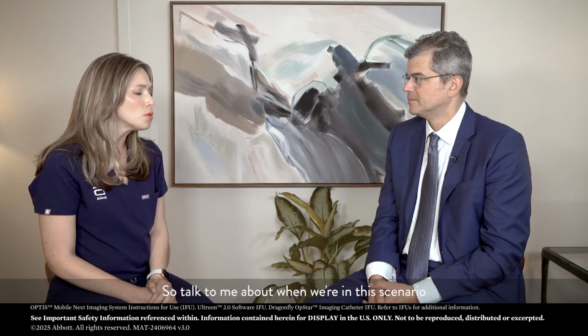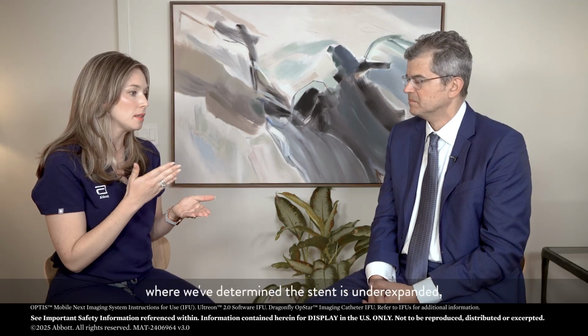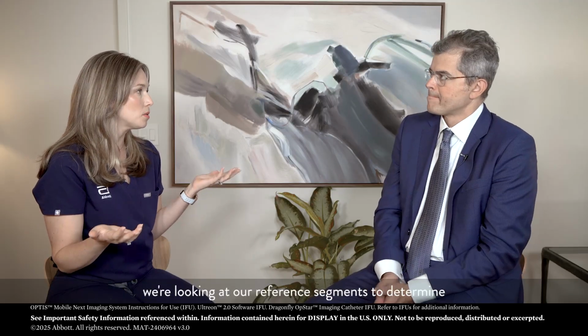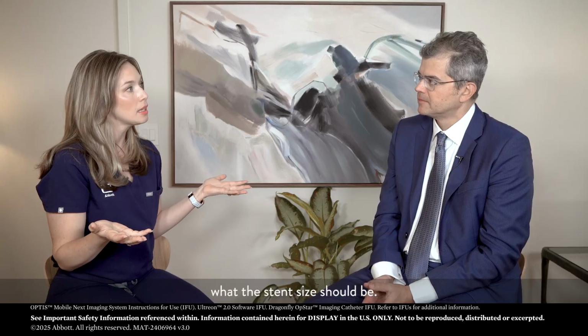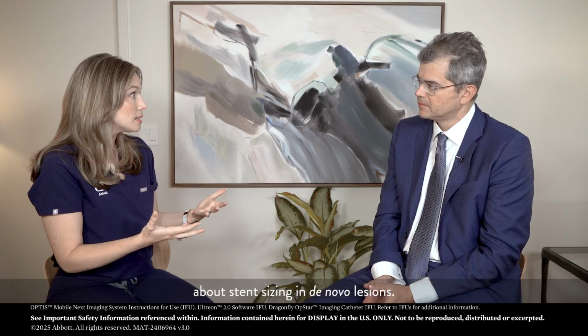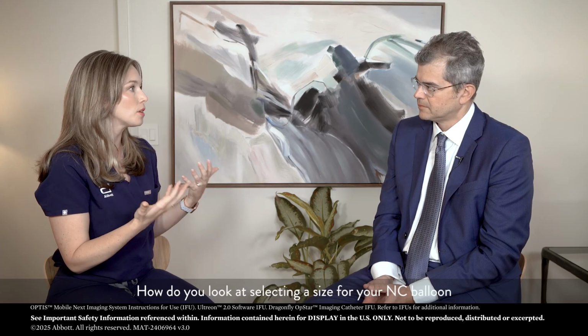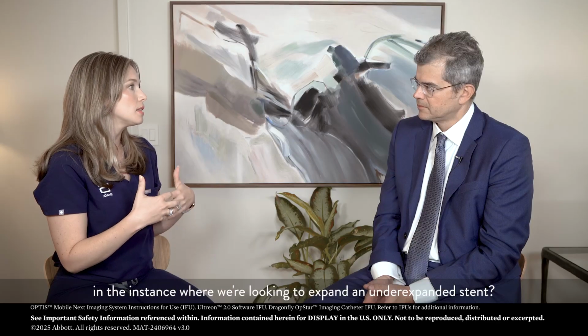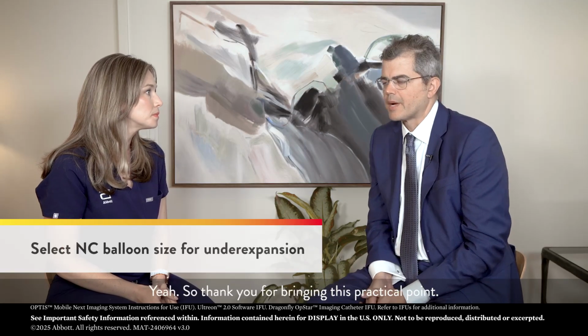That makes sense. So talk to me about, when we're in this scenario where we've determined the stent is underexpanded, we're looking at our reference segments to determine what the stent size should be. We talked in previous videos about stent sizing in de novo lesions. How do you look at selecting a size for your NC balloon in the instance where we're looking to expand an underexpanded stent? Yeah, so thank you for bringing this practical point.